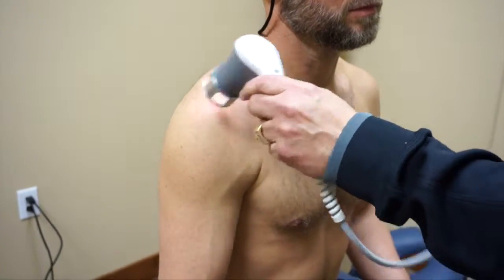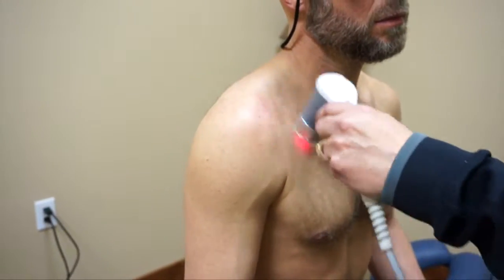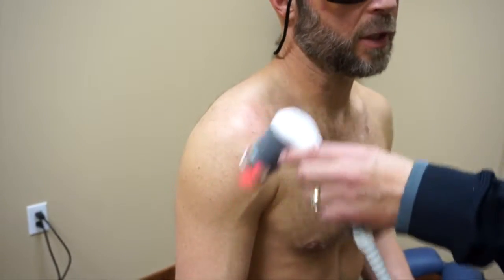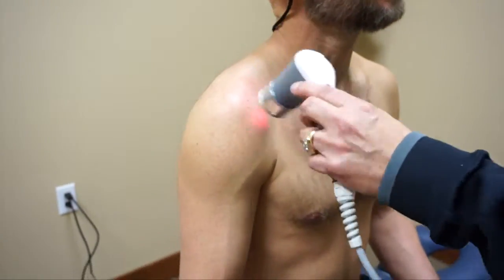You notice the heat builds up immediately — is it hotter? Yeah. At higher wattage, if I had 15 or 20 people to treat, it's a preferred wattage because I can get done a lot faster. Also, the darker the skin on the surface, the hotter the heat buildup will be.